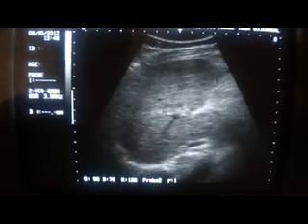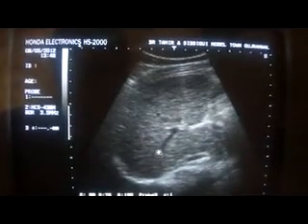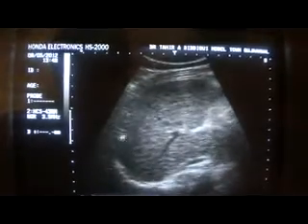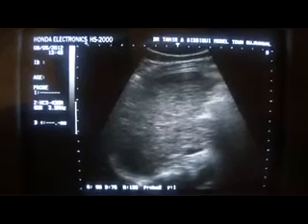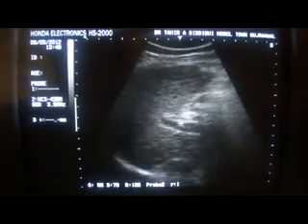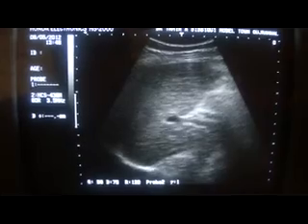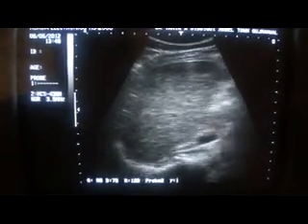Now see how a normal liver looks like and then compare it with the diseased. Just concentrate on the parenchymal echogenicity, the echobrightness. And now see this patient with a cirrhotic liver.